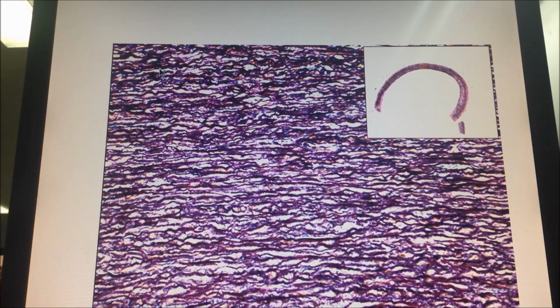So here the extracellular components are made by the smooth muscle. The type of collagen fibers in the wall of the aorta is also reticular collagen, type 3 mainly, and to a lesser extent collagen type 1, but mainly collagen type 3. So that's it.